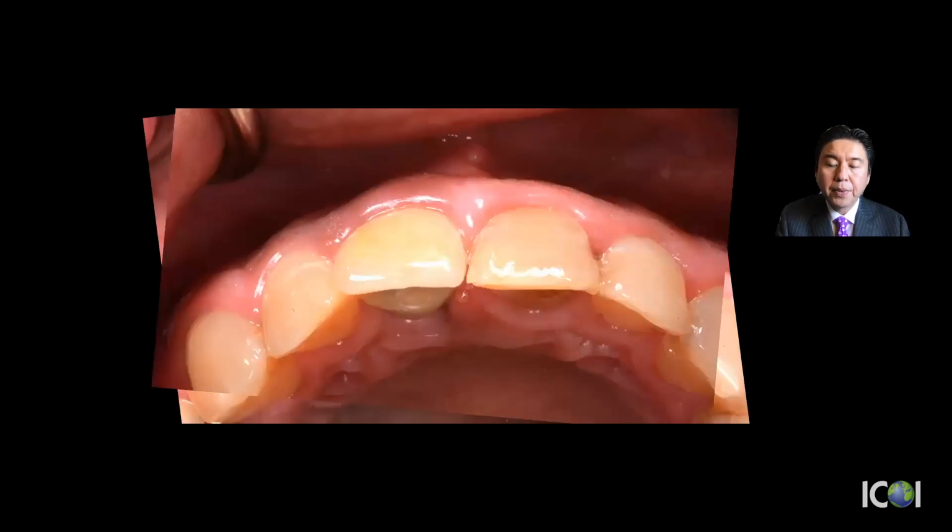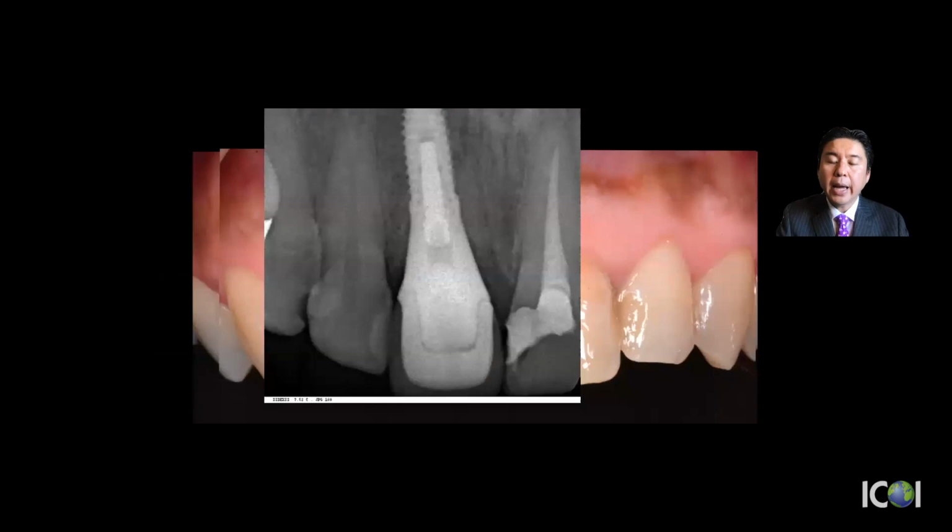Okay, so I put the final abutment and the final crown. You will see the contour. Okay, it's a little bit overbuilt. I pack it firmly. Okay, but you won't see any reduction. You will see the bone volume on the facial side. Okay, and this was made all digitally, just scanning. The abutment and crown were made from only the STL file. Okay, I don't have any model. Okay, everything is digital.